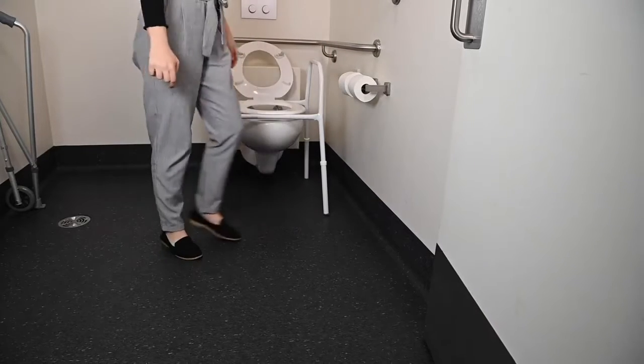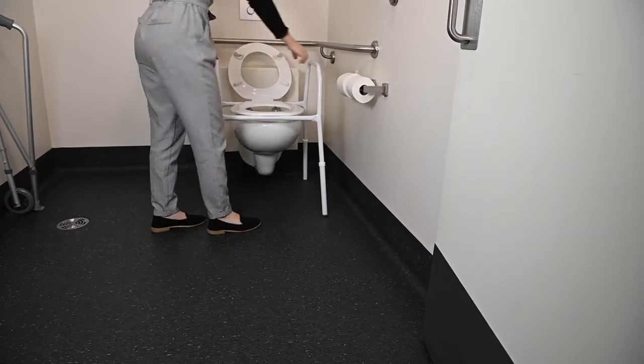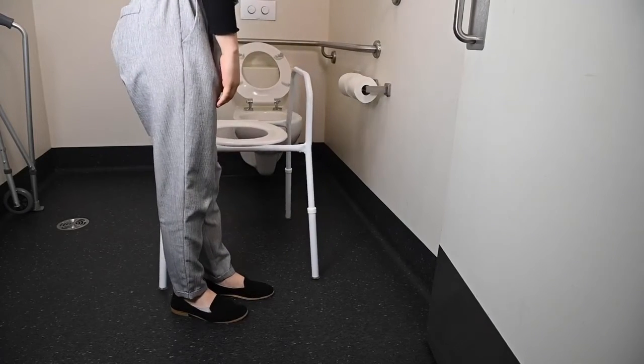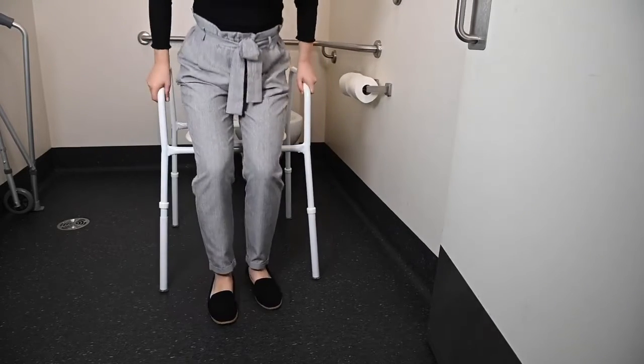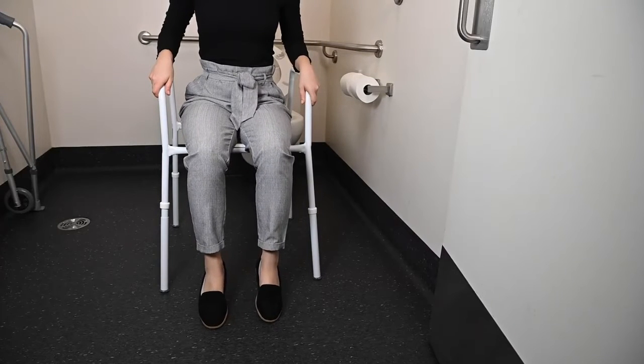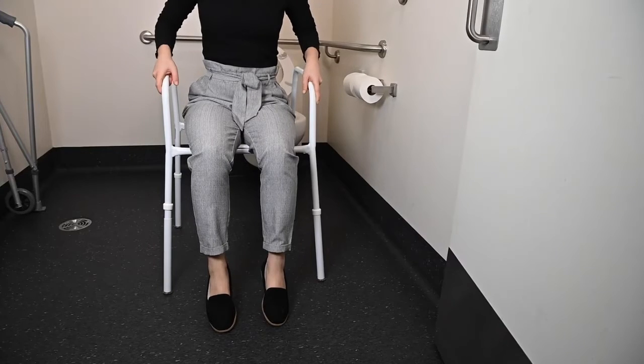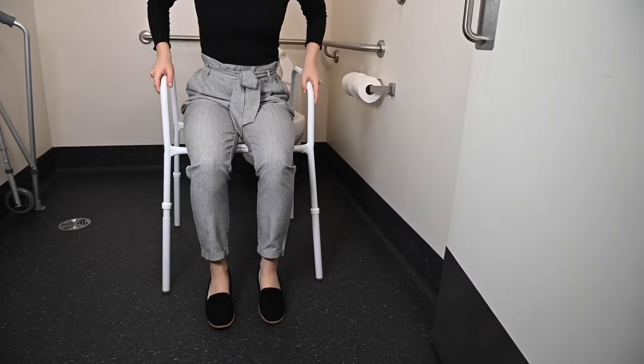Firstly, you need to ensure the over toilet frame is the correct height for you. You will know the correct height is achieved when you are sitting on the seat and your feet are as close to flat on the floor as possible, with knees equal to or below the hips. Please keep in mind that the frame needs to be tall enough to fit over your toilet.